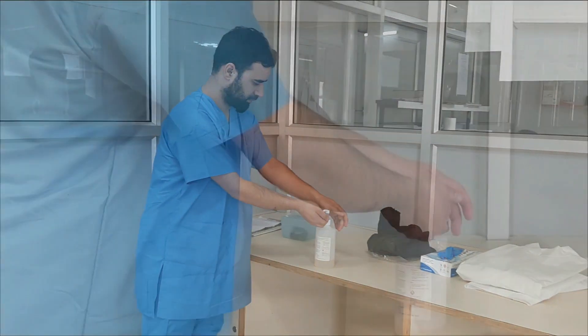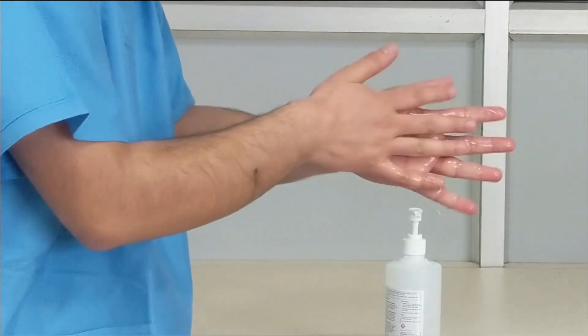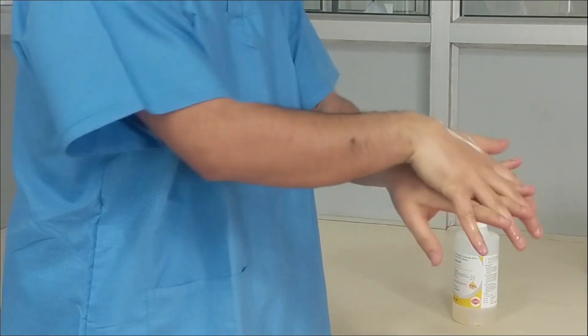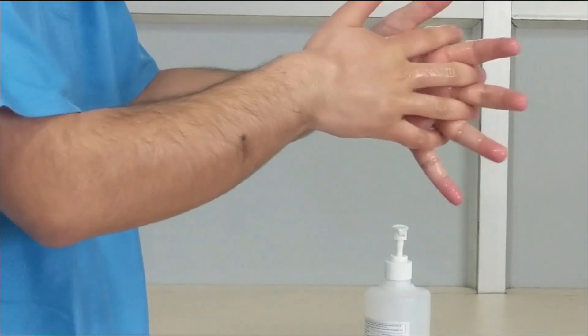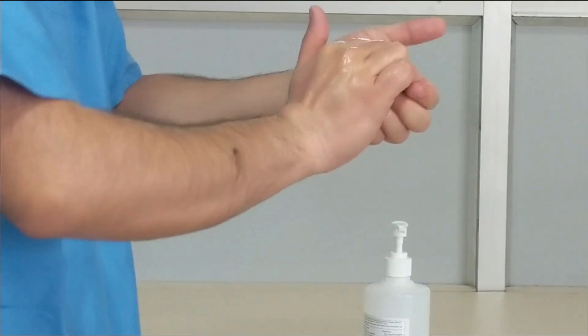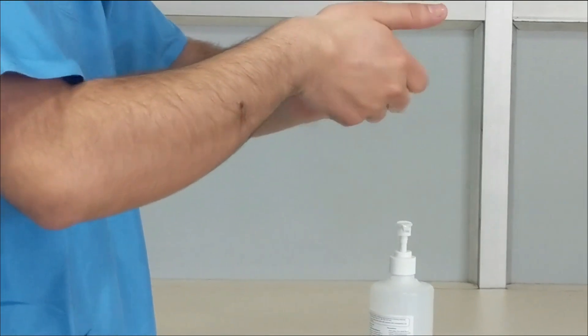It is very necessary to perform the seven steps of hand hygiene before donning your PPE. Rub a sufficient amount of hand sanitizer between your palms, finger webs, upper side of your hands, thumbs, and between the palms and wrists.